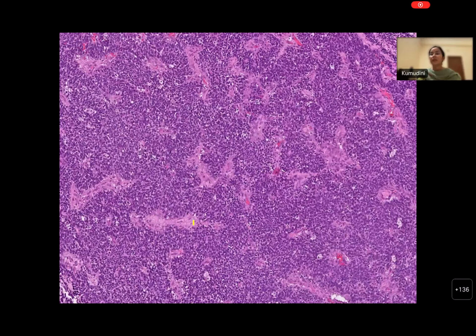So then it shows a highly cellular tumor, densely packed tumor cells with few hypocellular areas. Where are the hypocellular areas? These are blood vessels. I thought the hypocellular areas are the neuropil-like material. But where is it? At least in this power, you can say that there is a patchy hypocellular area, which is predominantly comprised of the blood vessels.